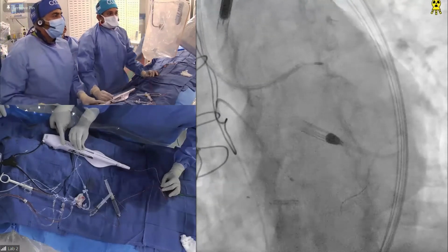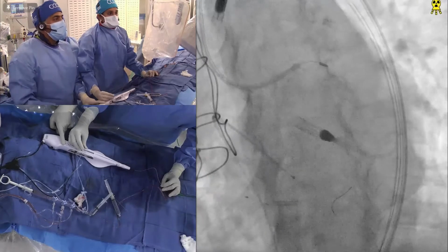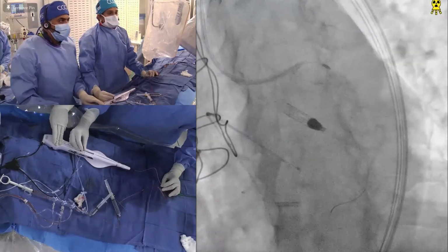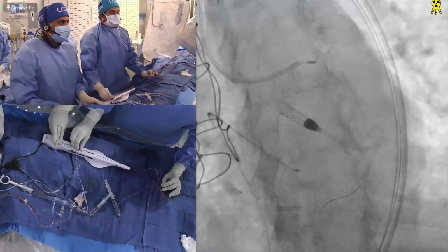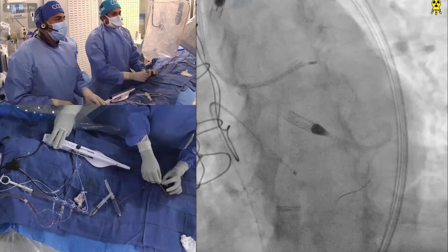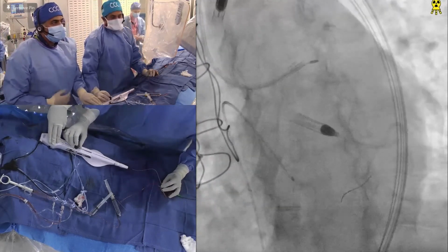So, yeah, Turnpike LP is what Dr. O'Neill was talking about as one of the go-to catheters. Okay, so let's see how you're going to do this. This could also get stuck in the calcium, especially the 1.25 burr, right? So let's see. A little more.